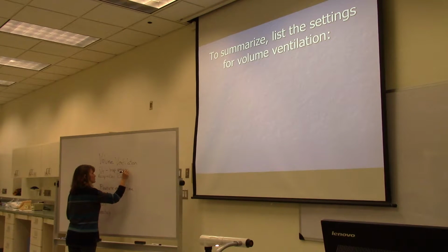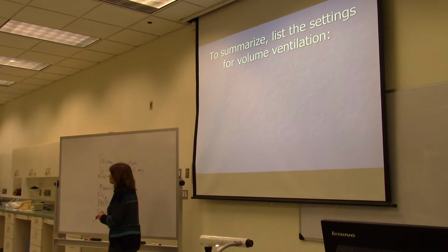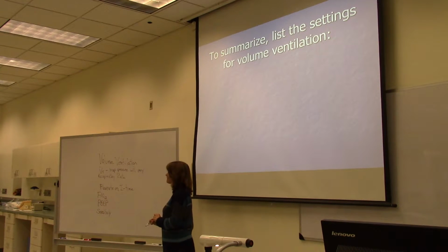Oh, it does tidal volume. Yes, when we push the air in, or deliver a tidal volume, more appropriately said. And you can change the tidal volume by changing the PIP, right? In pressure ventilation, yes. But this is volume ventilation.